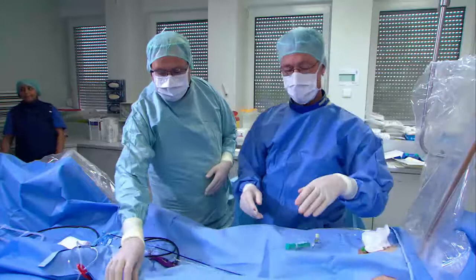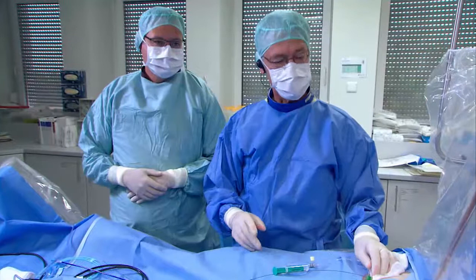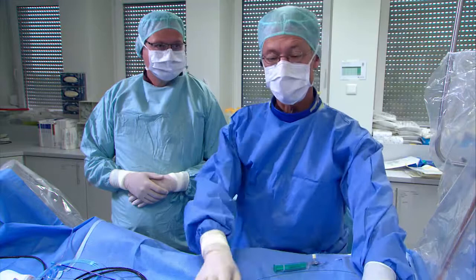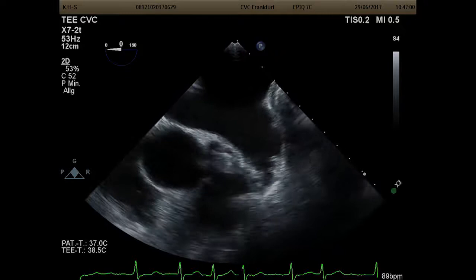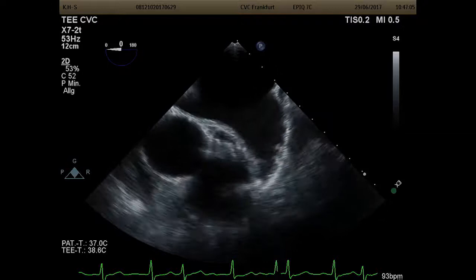With me is Markus Reinhardt, and Martin Swans doing the TEE. Martin, can you show us what you have on the TEE screen? We already introduced the probe. For an LAA closure, we have to do several measurements and we're going to put in an Amulet device. We go around the LA, measuring the different dimensions and depth, which are important for implantation. We typically go from zero to 45, 90, and 135 degrees.